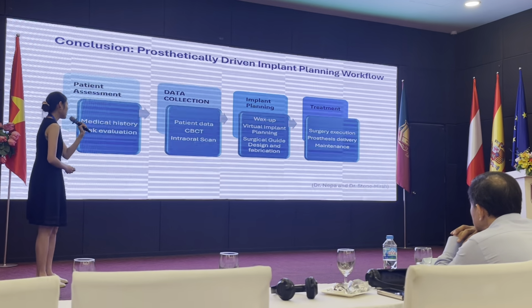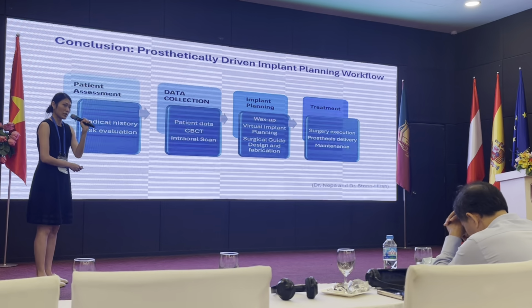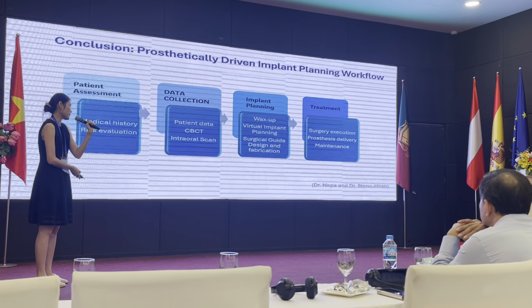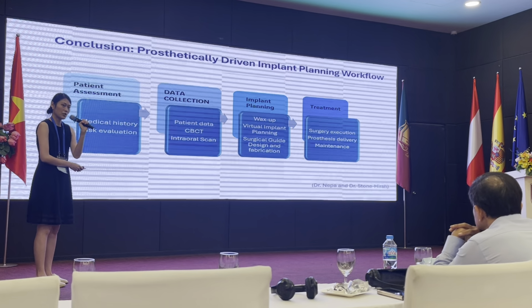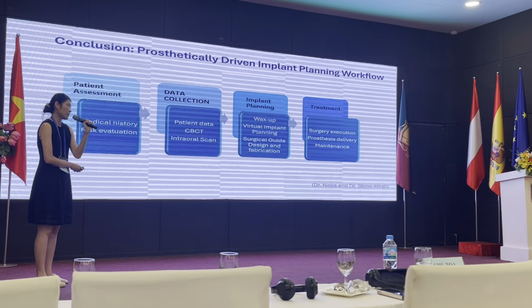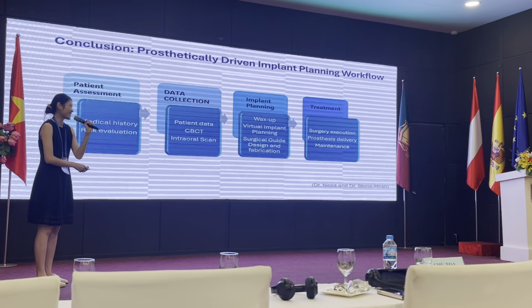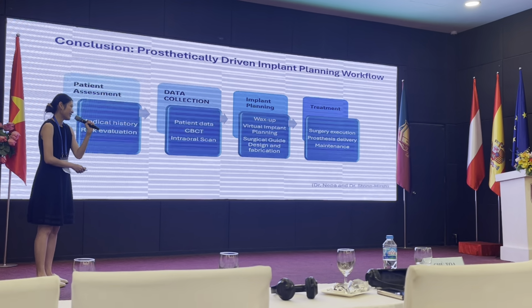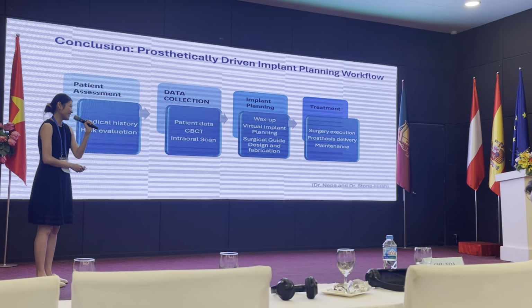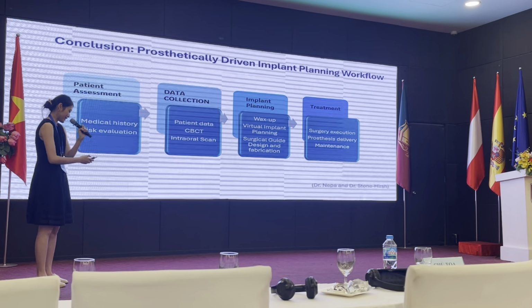And after that, after you got your diagnostic test, you can either go with the analog workflow, do the diagnostic wax up with the traditional wax, or you can do it virtually, doing the virtual wax up as well. And from there, if possible, try to do guided surgery as much as you can, because that can make sure the position is ideal three-dimensionally. And eventually, you will go into the surgery. So surgery should be the last step, and then that can make sure you have the success prosthetically. And not only that, after the treatment, you want to make sure your patients come back. Maintain the oral hygiene and also the prosthesis.